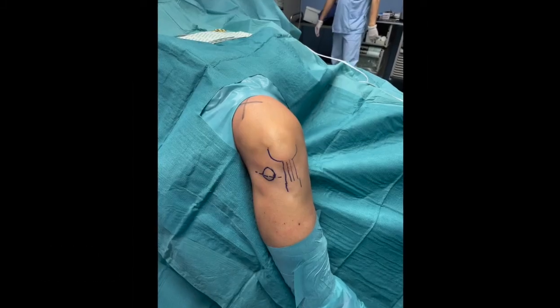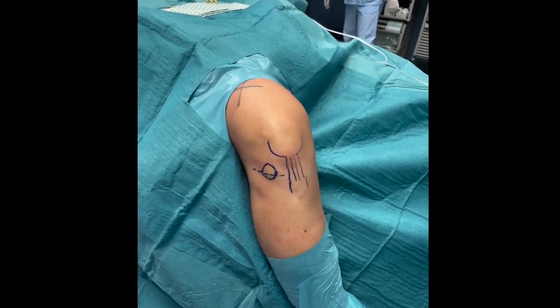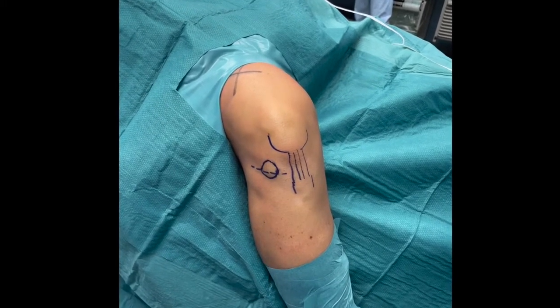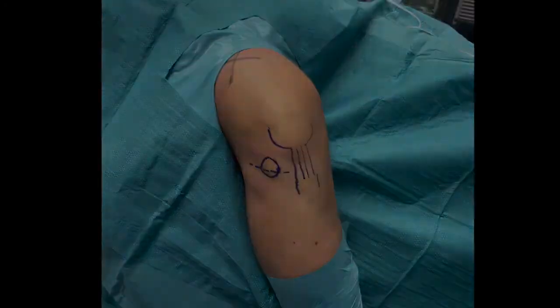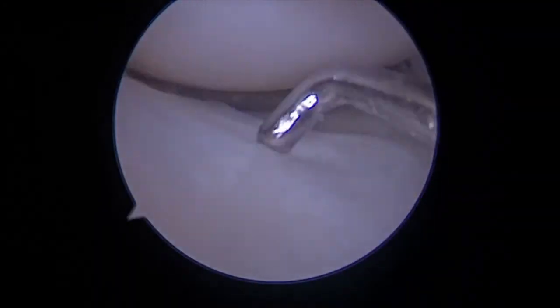The parameniscal cyst, joint line, patella, and patella tendon are marked with a sterile skin marker. The horizontal tear of the lateral meniscus is probed to evaluate its stability.